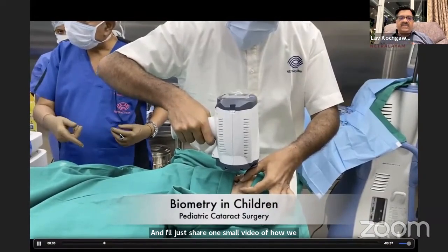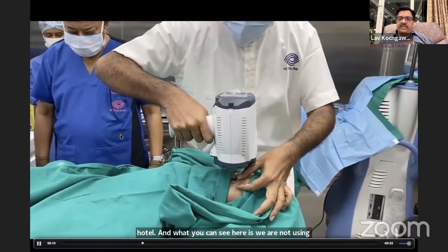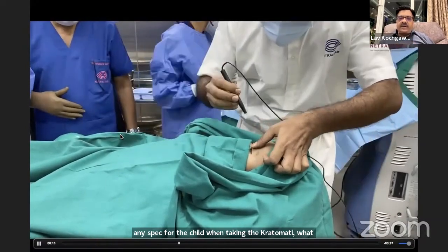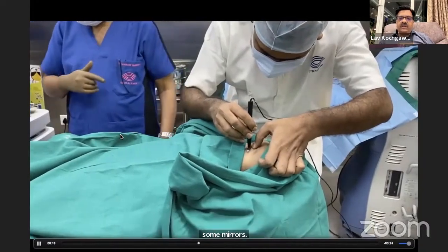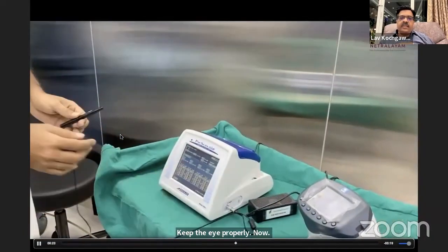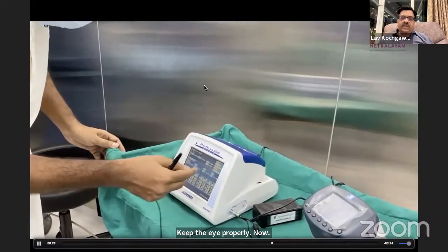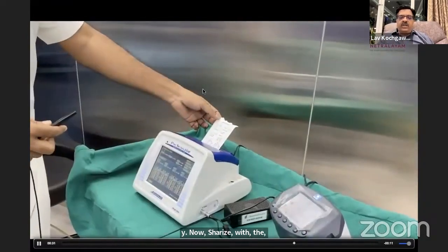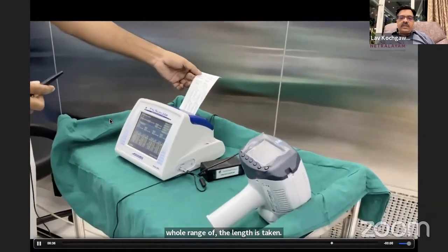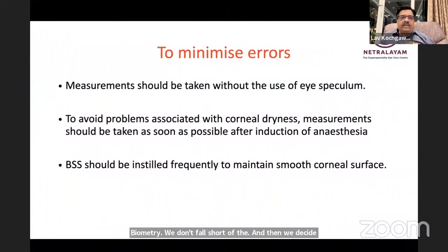What you can see here is we are not using any speculum for the child when taking the keratometry reading, because that can cause some errors. Keep the eye properly moisturized with normal saline or balanced salt solution, after which the axial length is taken. We keep the whole range of IOL with us so that once we get the actual biometry reading, we don't fall short of the IOL. Then we decide on which IOL to implant.